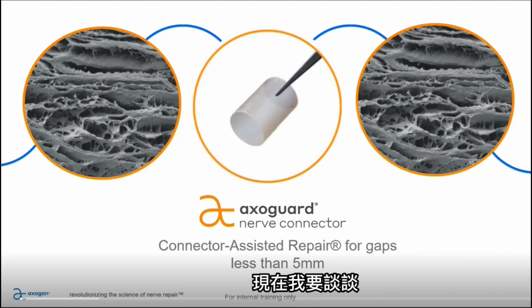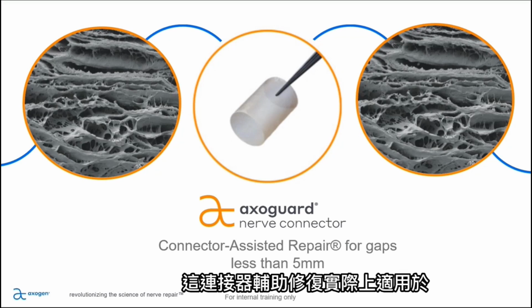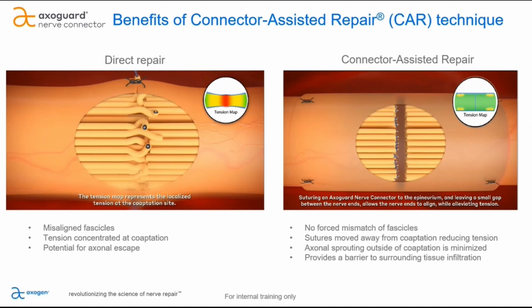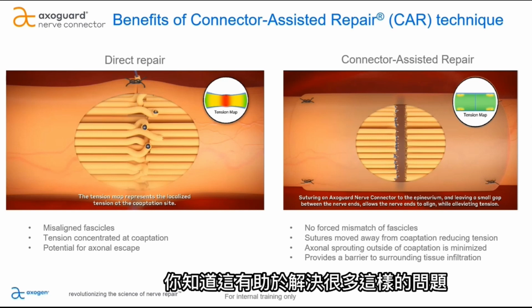Now I'm going to talk about using the AxGuard nerve connector in this technique that we call connector-assisted repair. This connector-assisted repair is really meant for gaps less than 5 millimeters. So again, with direct repair, you can very easily misalign your fascicles. You put tension at the coaptation, and you have the potential for axonal escape. With connector-assisted repair, this helps to solve a lot of those problems.